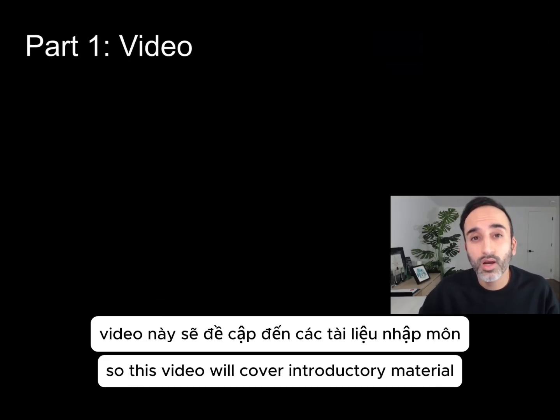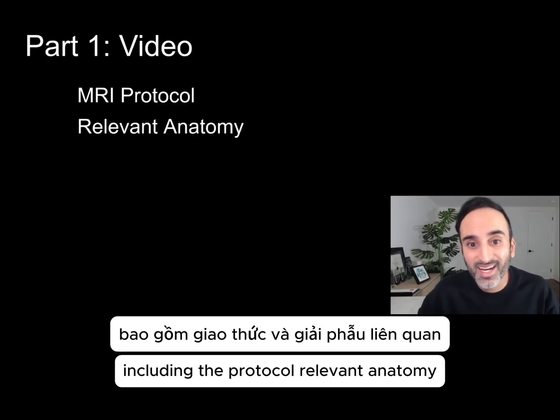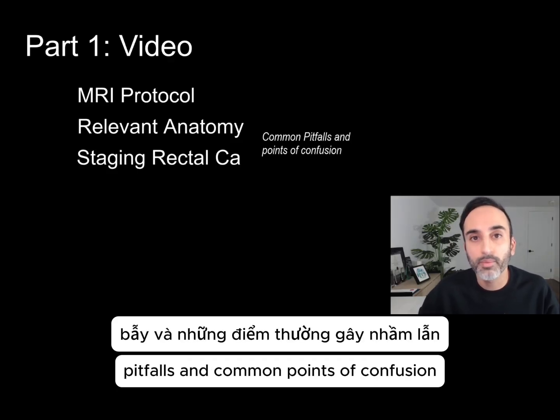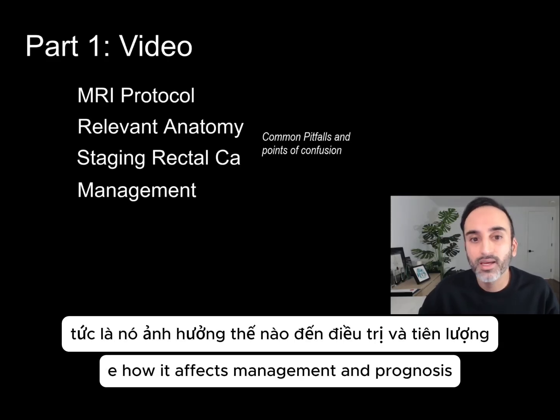So this video will cover introductory material, including the protocol, relevant anatomy, and how to stage rectal cancers with a focus on common pitfalls and common points of confusion. We'll also talk about why staging matters, i.e. how it affects management and prognosis.